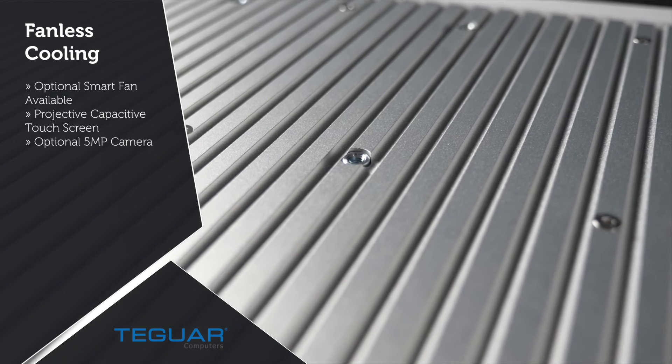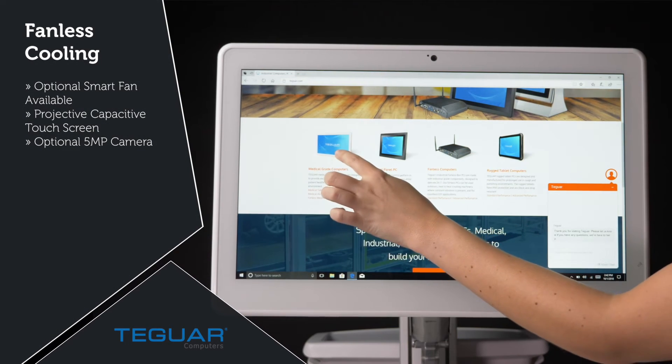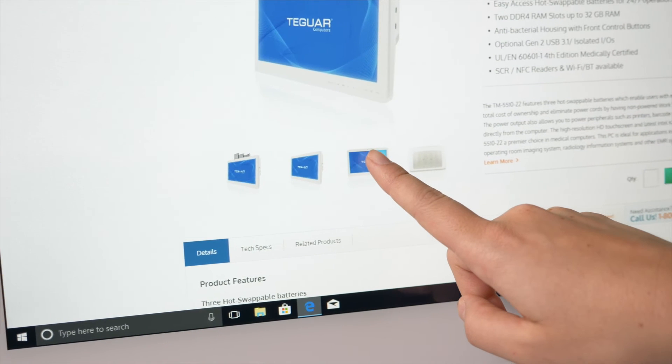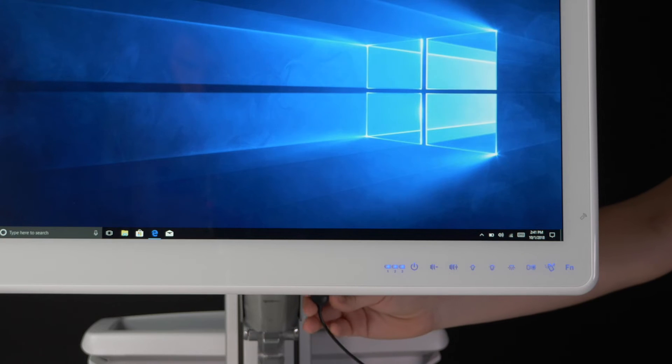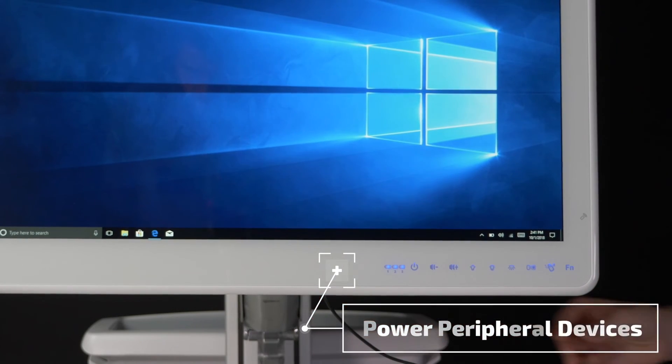This PC has a fanless CPU with an option for a smart fan, which means faster processing power. The TM551022 has multiple I/Os, which means you can plug in a plethora of peripherals, including barcode scanners, printers, and card readers.